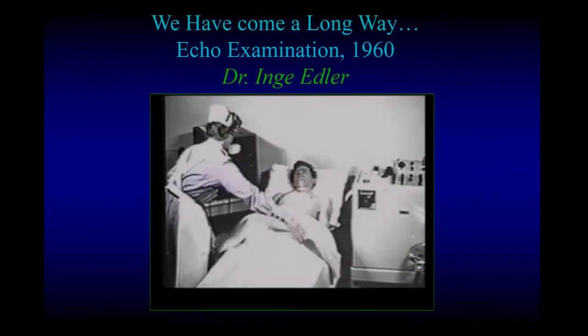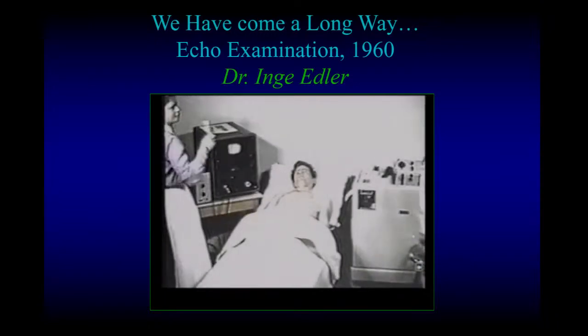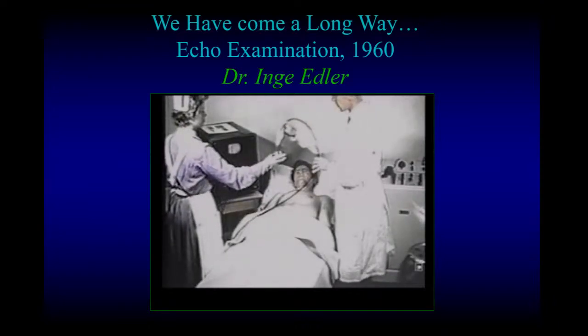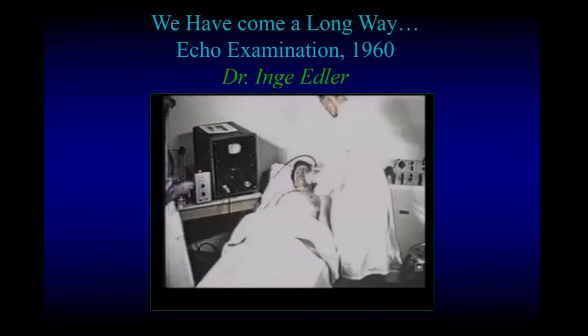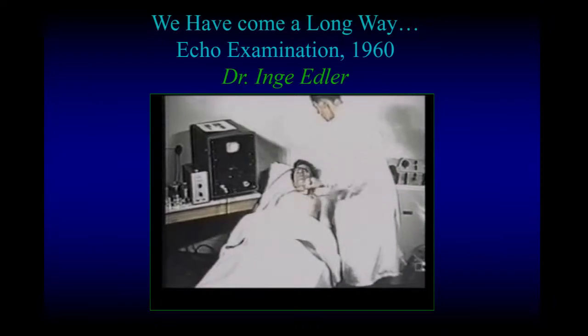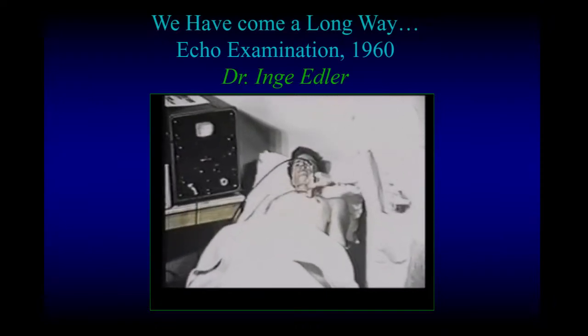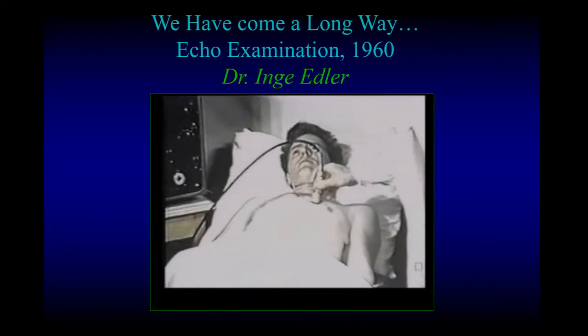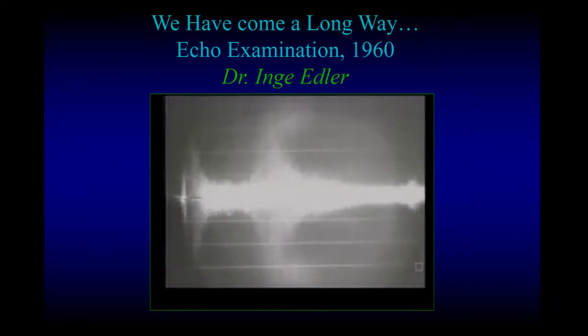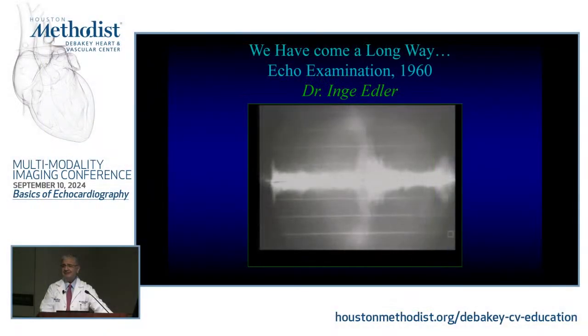This is the new dress code for our sonographers. And a little drop. And probably the worst position to get an ultrasound, with your left hand in your pocket. And that's what you're able to see. All right? This is an A mode of a mitral valve. But it's amazing, actually.